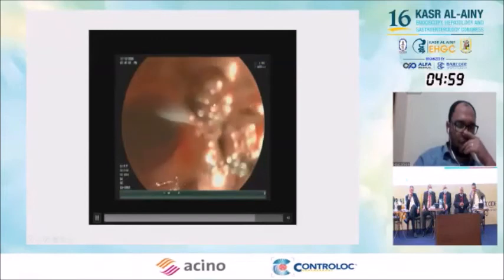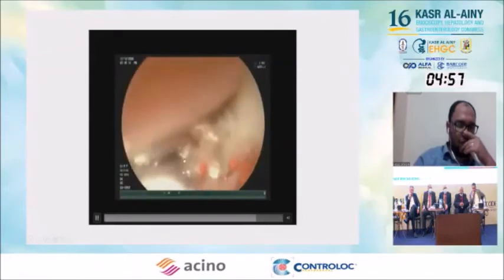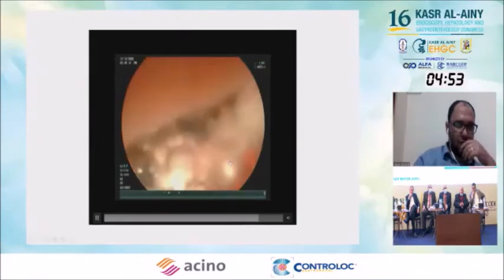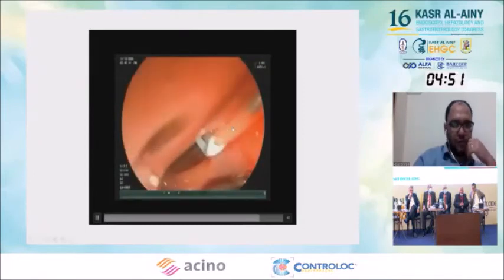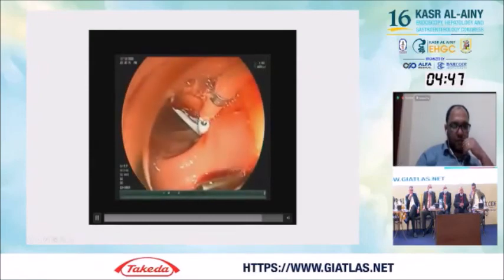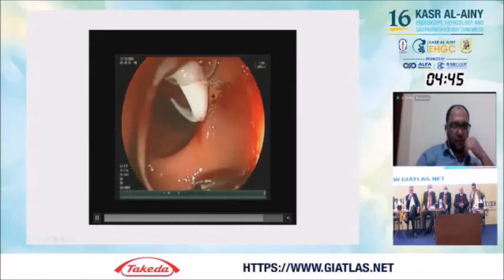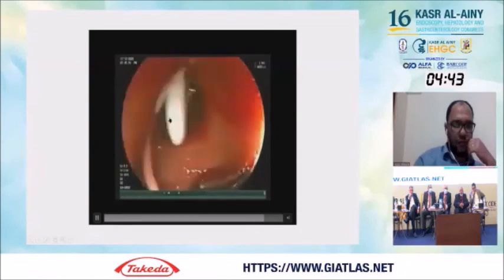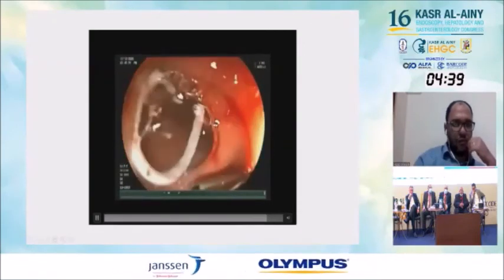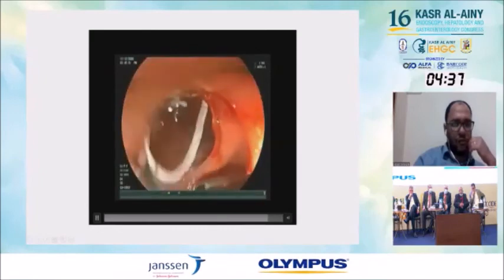Finally, deploy it. The guide wire is here, so I'm sure that the stent is outside. I remove the guide wire. And this is the last result.